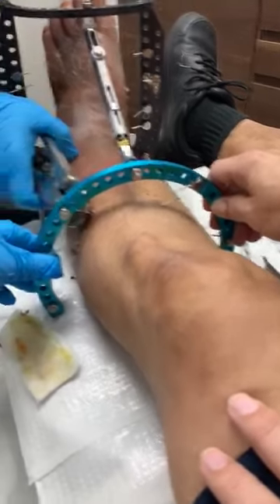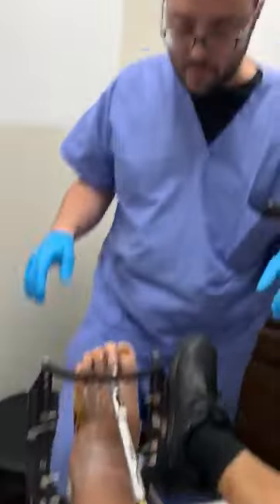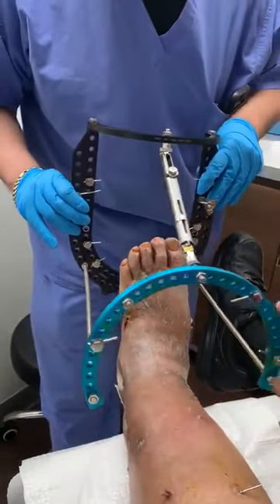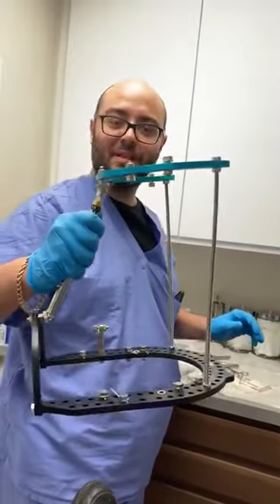Ready? One, two, and three. Now what we can do, we can actually lift the frame off. Look at that. There you go. So you see something here? Well, that's how you remove an X-Fix.